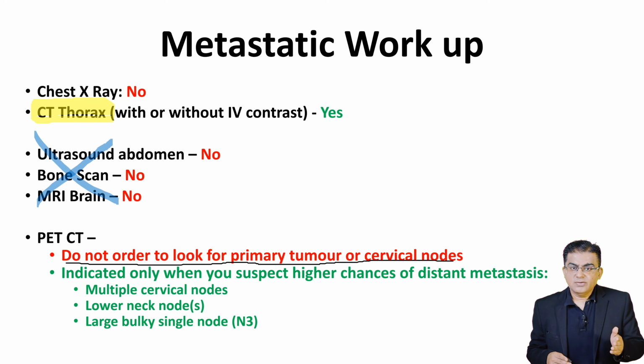Why? First of all, you remember the meta-analysis by Leo et al. I showed you. It consistently showed that PET-CT is absolutely no better than high quality CT or MRI for detecting occult cervical nodes. Second, FDG is not cancer specific. You know what else lights up on a PET scan?